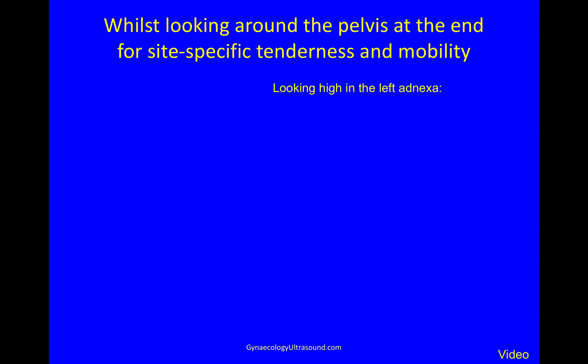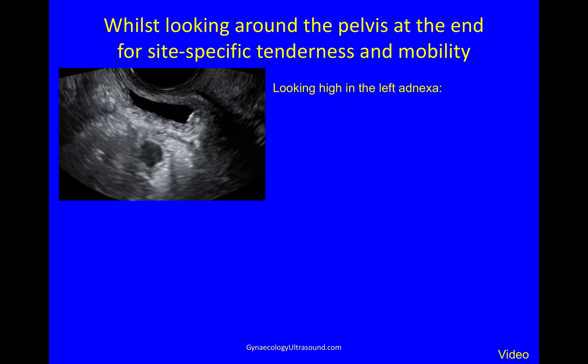At the end of the scan, when you've done your systematic scan, you need to look around for site-specific tenderness very, very gently. As you go around the pelvis pressing on individual organs, asking whether it is sore, you can also judge mobility straight away. While I was doing that, looking high in the left annexa, I could see this hypoechoic nodule there.